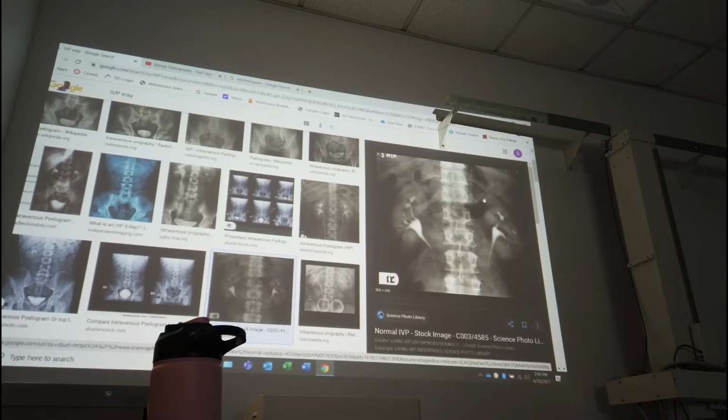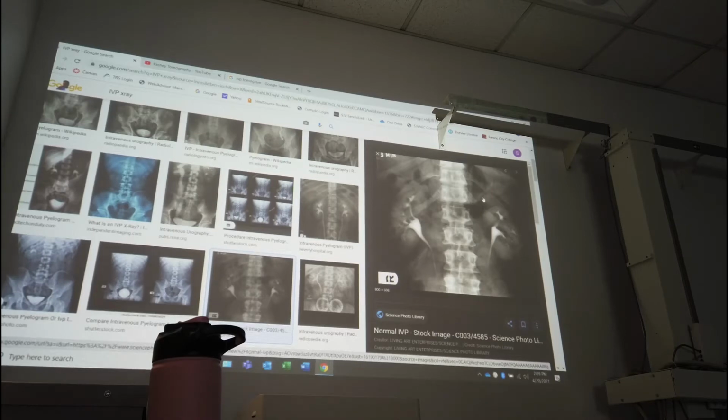It's a good study because a lot of people end up with urinary tract infections. And the reason why they have urinary tract infections sometimes is maybe too much sexual intercourse. But also sometimes the urine will reflux back up into the ureters again. And when that happens, it's not a normal flow and it can cause urinary tract infections. But that's not a very fun exam.